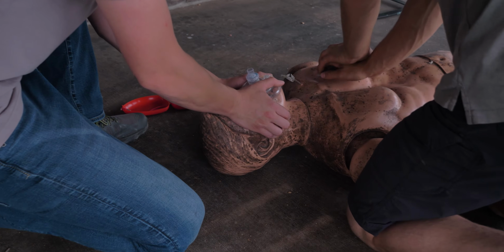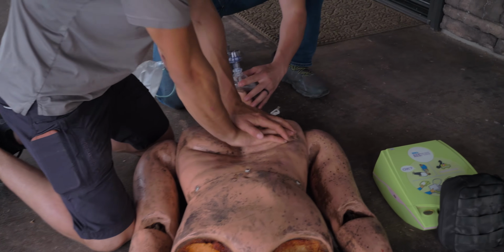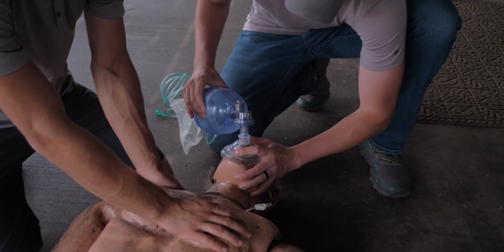While you're waiting on an AED arrival, go ahead and begin compressions. If you are trained in giving breaths with a pocket mask or a barrier device or a BVM, you can do the breaths. What we do is we do 30 compressions and 2 breaths. If you're not trained in that, simply do compressions. Just do nonstop compressions until the AED gets there and says to stop compressions to analyze or to shock. Otherwise, you just keep doing compressions until the ambulance arrives. These compressions will keep the circulation going to buy the patient time until they do get defibrillated or until the ambulance gets there to be able to provide further treatment as well.